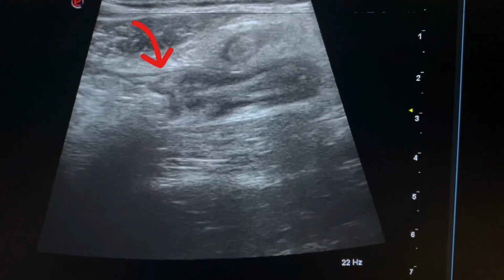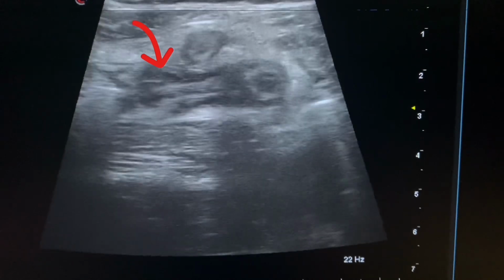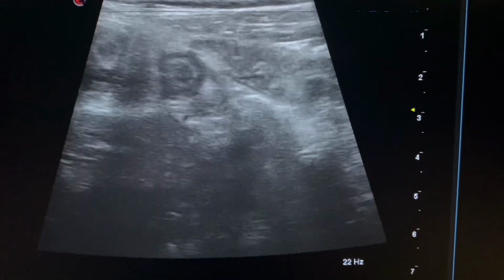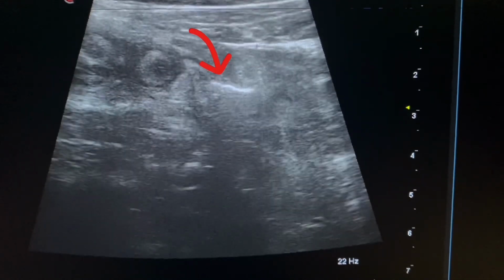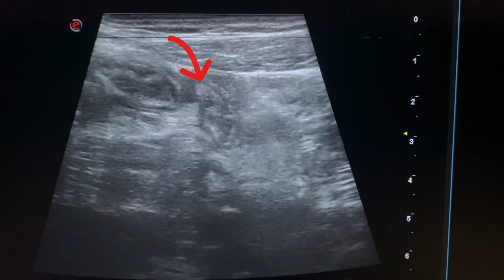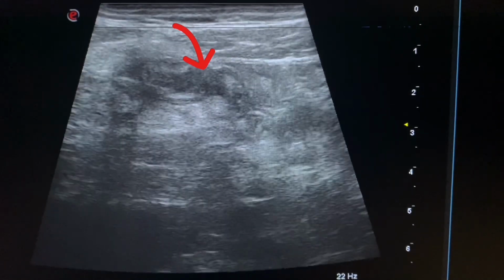The part of the distal ileum at the ileocecal junction is inflamed, but the other part appears normal, mildly prominent with absent gases.